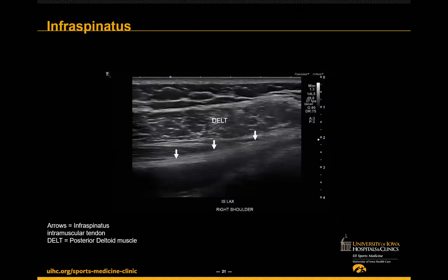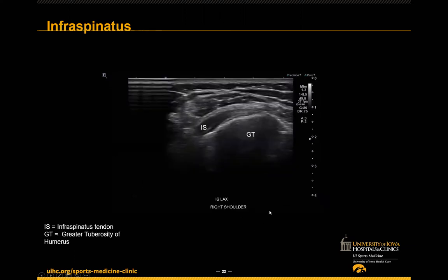From there, slide superior and visualize the infraspinatus. I like a view of the muscle with the central tendon — you can see the nice pinnate structure coming down onto the central tendon of the infraspinatus, which helps in making a call for fatty infiltration. Then follow out toward the insertion on the greater tuberosity. Posteriorly, I'm predominantly looking at the muscle here. The infraspinatus and supraspinatus should really be thought of as one tendon — the continuity of the rotator cuff. I like to evaluate that starting at the rotator interval and working back, as one structure.